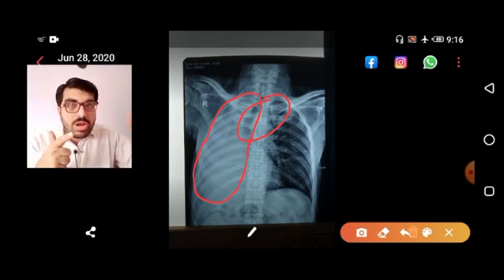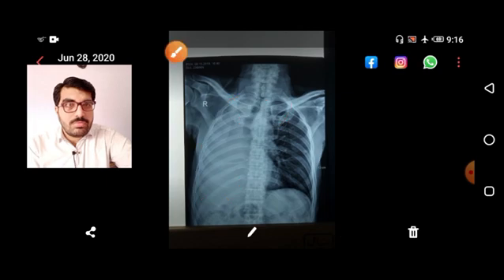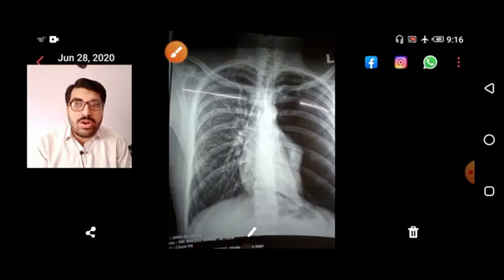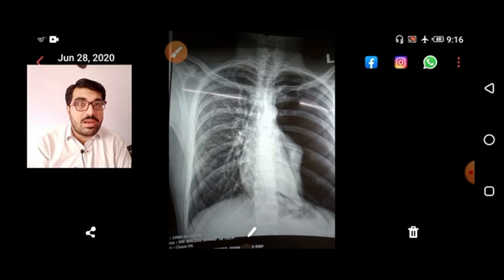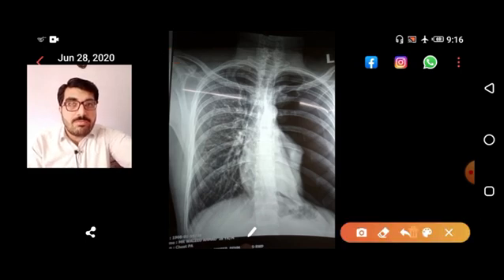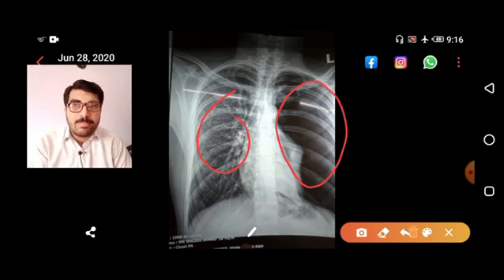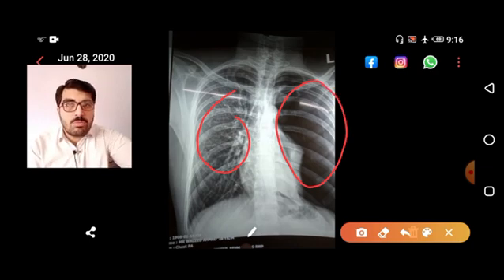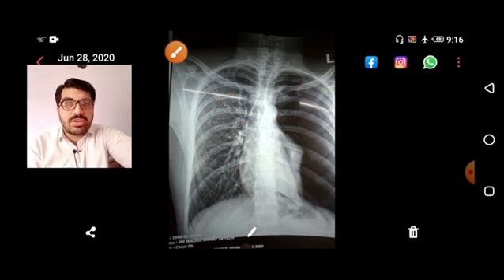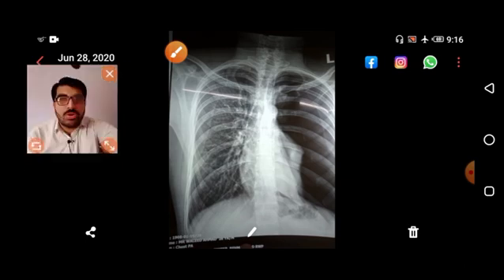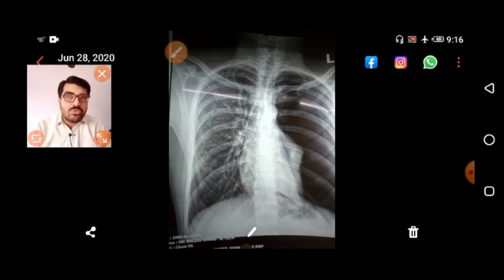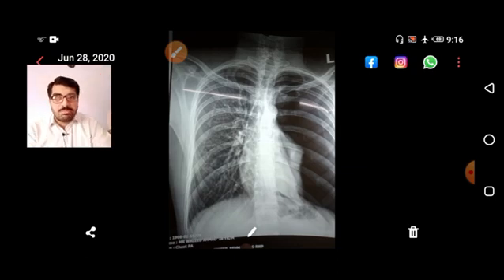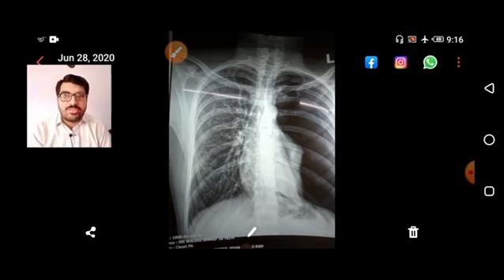Moving to the next X-ray — this is very typical. Compare both sides: there are no lung markings on the left side, but there are normal lung markings on the right side. The diagnosis is pneumothorax on the left side.